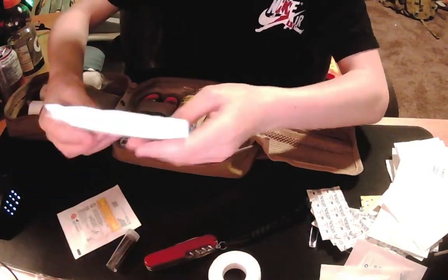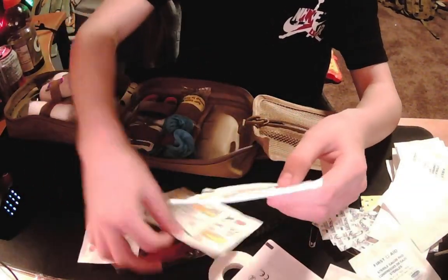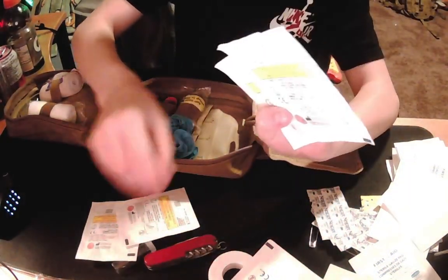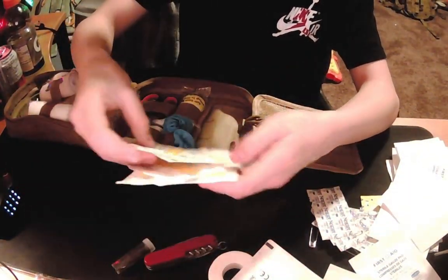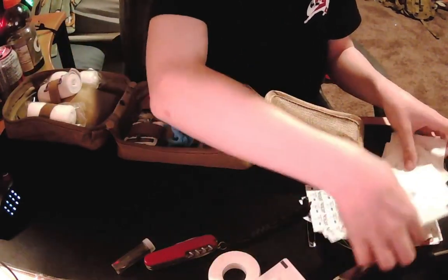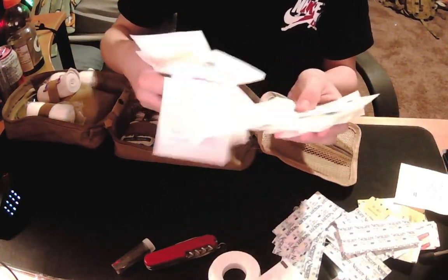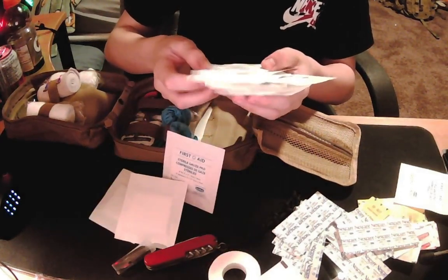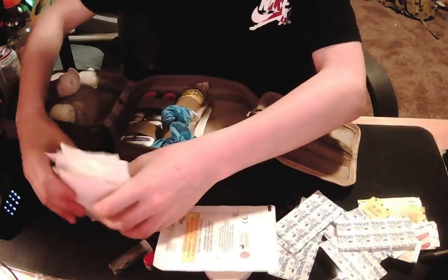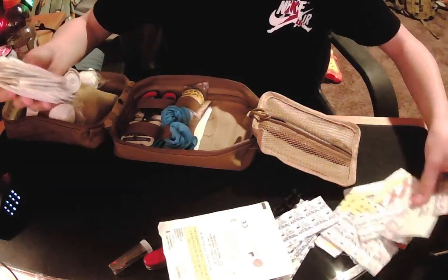Over here I have a non-adherent pad, and then these are just dressings — gauze sponges, four large ones and four smaller ones. And then over here I have a whole ton of more dressings. These ones are five centimeters by five centimeters — pretty small, but there are a lot of them. There are two in each pack, so in total I have 32 of them.